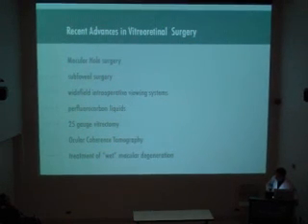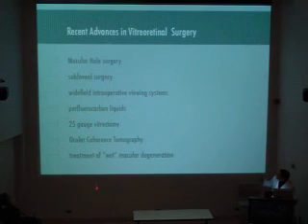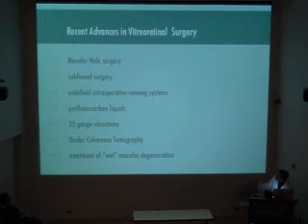So, we'll see some more examples of that. But the following is a list of really major advances we've had in retinal surgery, all really within the last 10 years. Macular hole surgery, which we'll talk about. Subfoveal surgery, meaning we actually operate underneath the retina to resolve problems. We've got much better viewing systems, wide field viewing systems that allow us to see details that we could never see before surgically. We use a class of liquids called perfluorocarbon liquids that are heavier than water, which allow us to repair conditions which we couldn't repair.